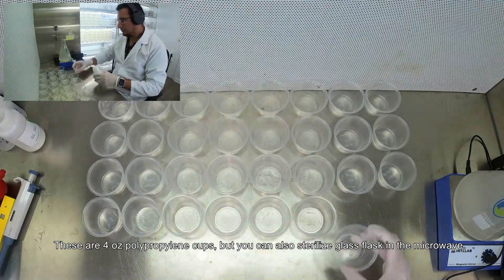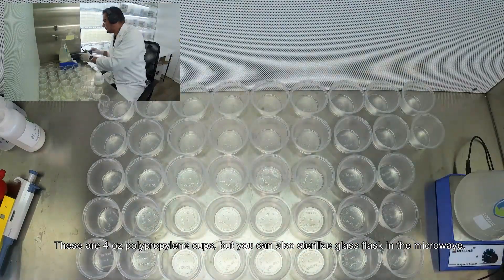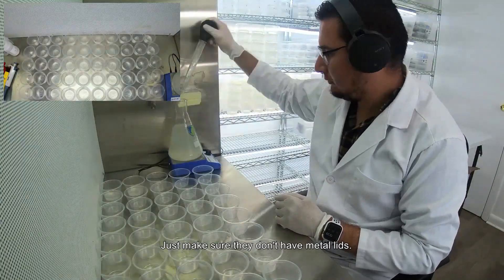These are 4-ounce polypropylene cups, but you can also sterilize glass flasks in the microwave. Just make sure they don't have metal lids.